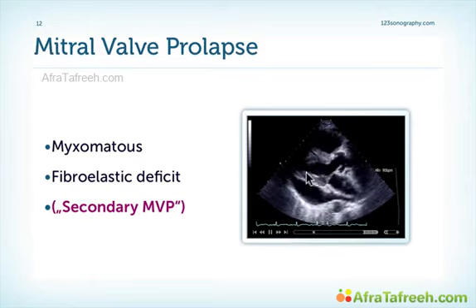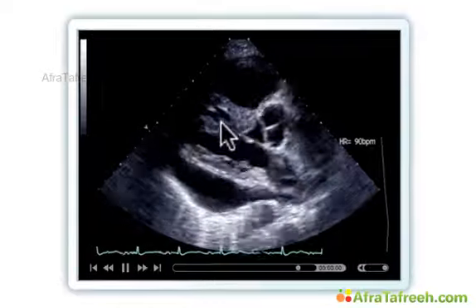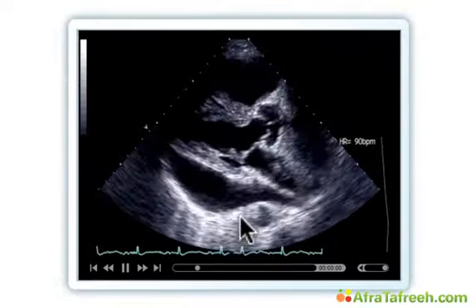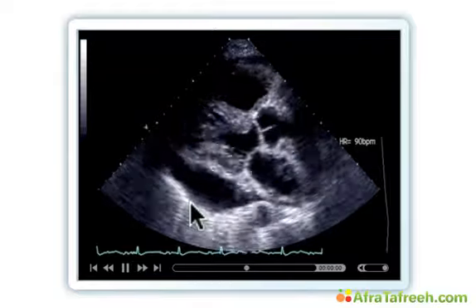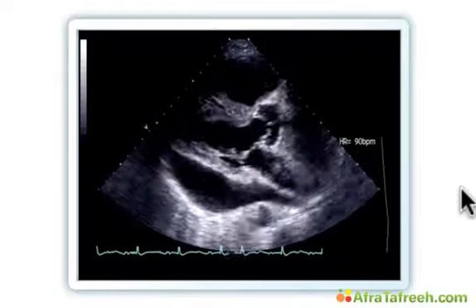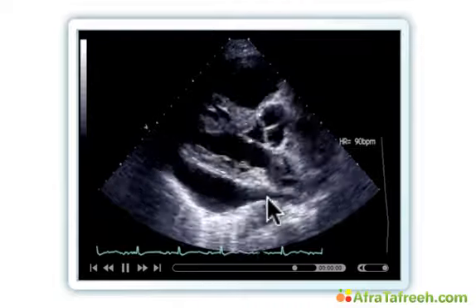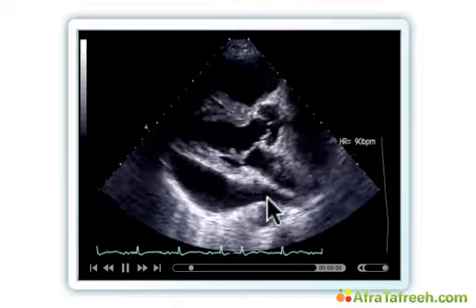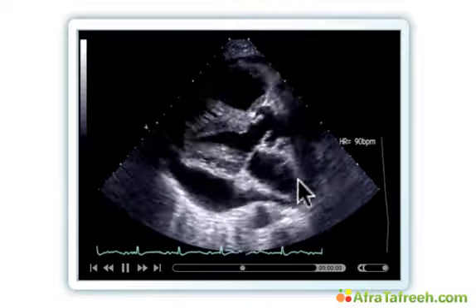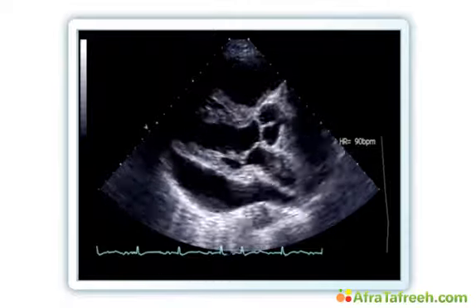There are several reasons why we have compression of the mitral valve annulus. For example, in this case, we have pulmonary hypertension with a small left ventricle and also pericardial effusion. You can also see such forms of prolapse, for example, in hypertrophic cardiomyopathy. Usually, this form of prolapse, however, is not related to severe or significant mitral regurgitation. So, this very rarely presents some sort of problem.